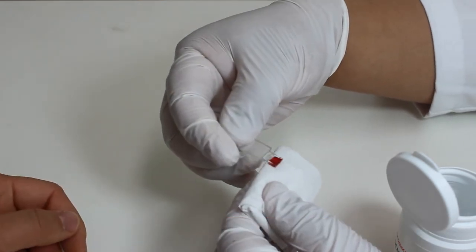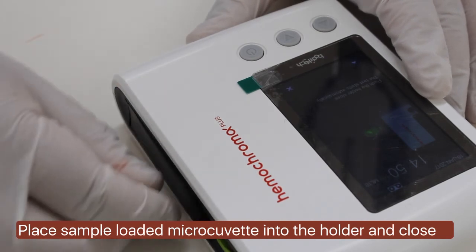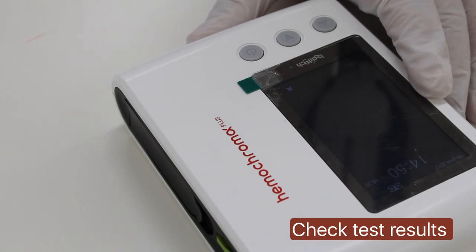Then immediately place the sample loaded micro-cuvet onto the holder. Close the holder completely and the reader runs the test automatically.